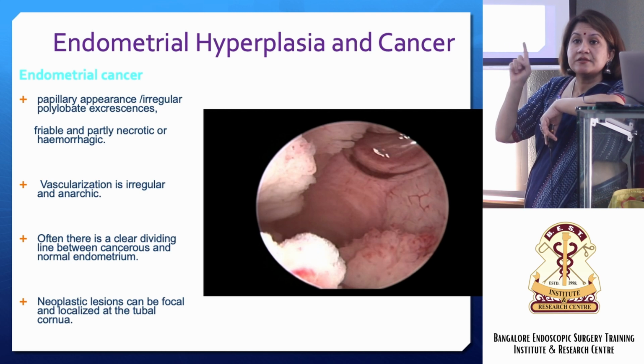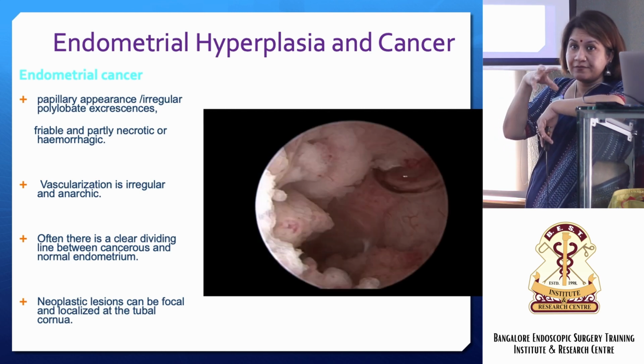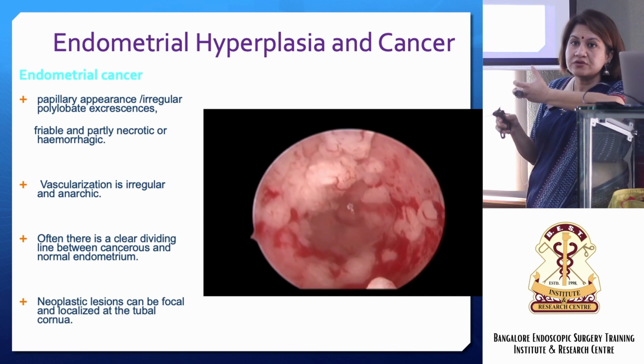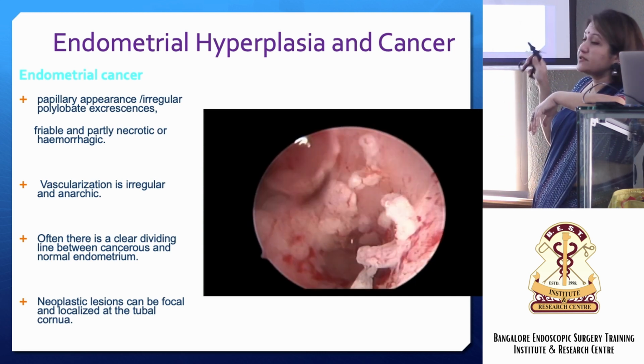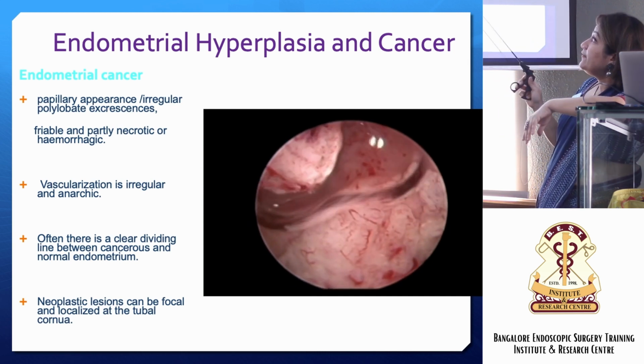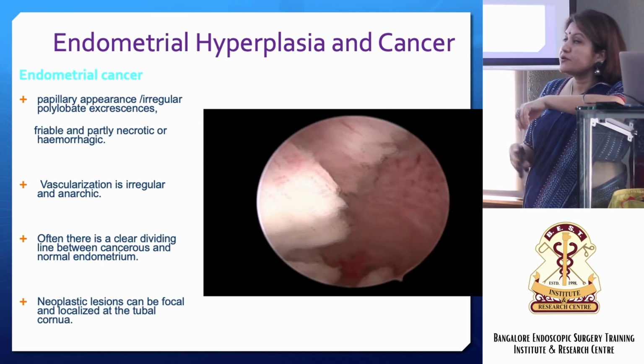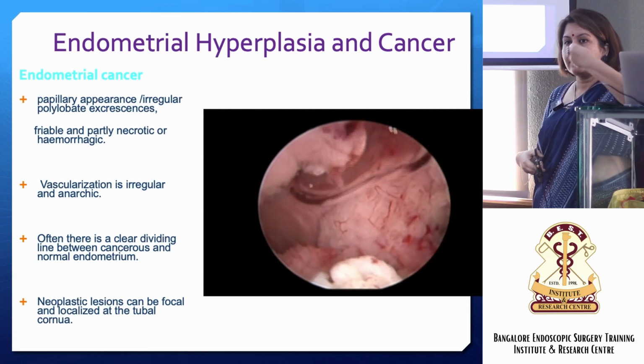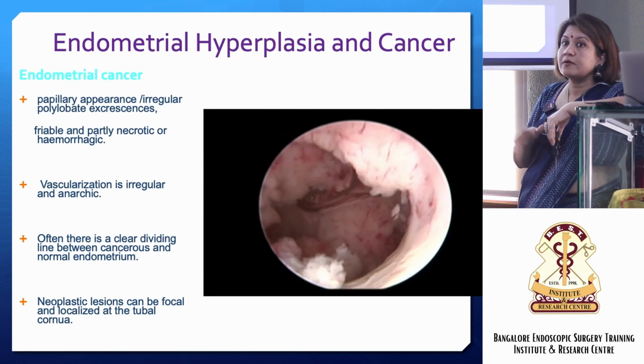When you curette, sometimes the tissue doesn't come out. A lot of tissue does, when it's very fibrous, I don't know. Sometimes with this malignancy, when you curette, tissue doesn't come as much as you think it will for this kind of thickness. When they're friable, they come out. When they're not friable, sometimes they don't. So you can use a scissor and cut this chunk, the base of it, and pull out the tissue. So you have not missed anything.